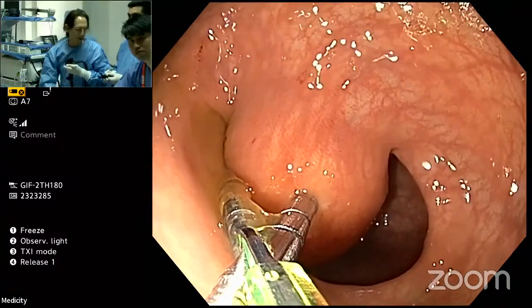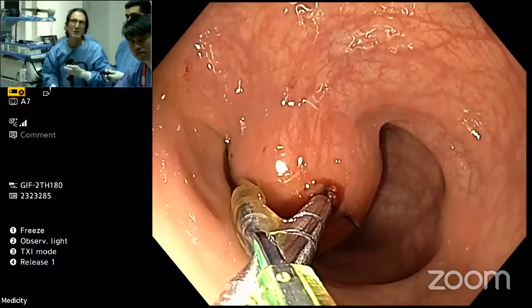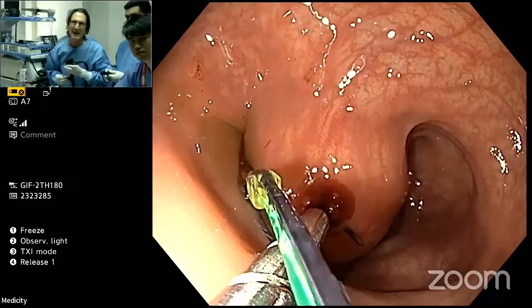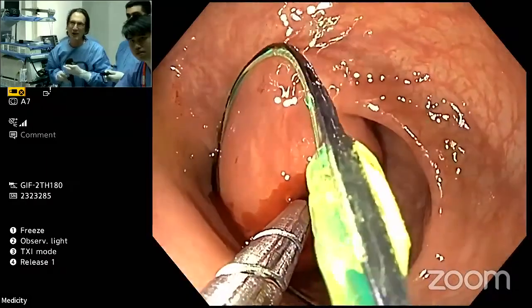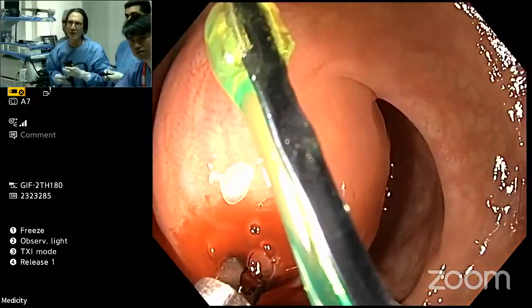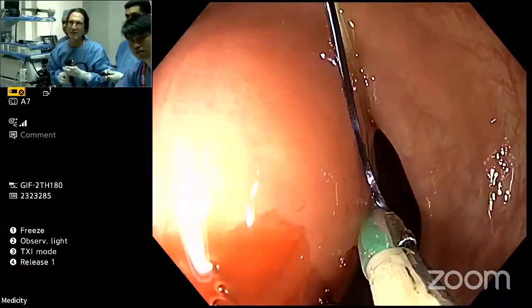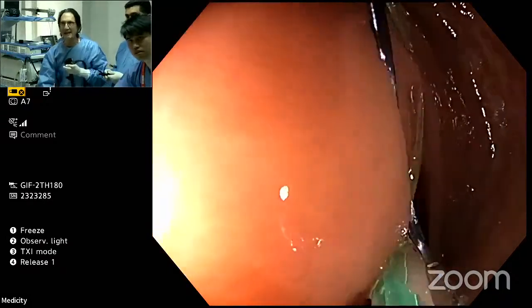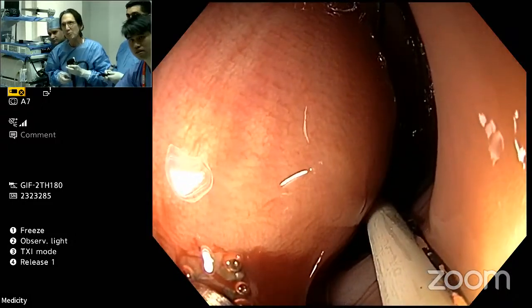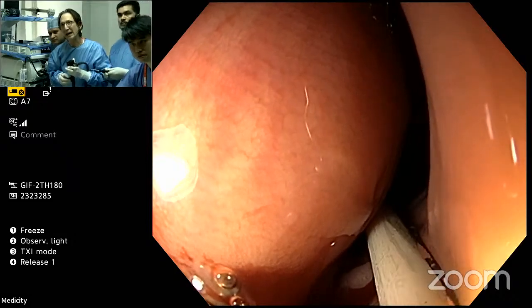Go ahead and deploy the three-prong grasper. So now just push it out. You see one of the prongs kind of came out a little bit, and that's okay. Now I'm going to push this second one forward. This is the loop. And I'm going to pull this in forcefully. So I'm getting the loop all the way out like this, putting it flush up against, and I'm pulling back like this. And you can pull back pretty forcefully so that I'm really pulling, if you will, the attachment to the MP. I'm involuting the wall.